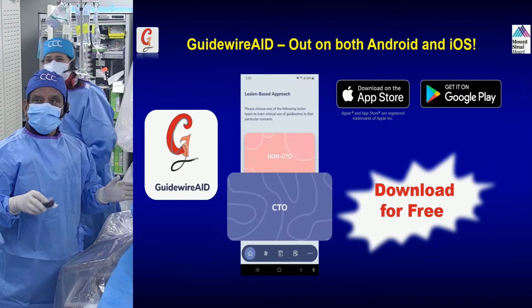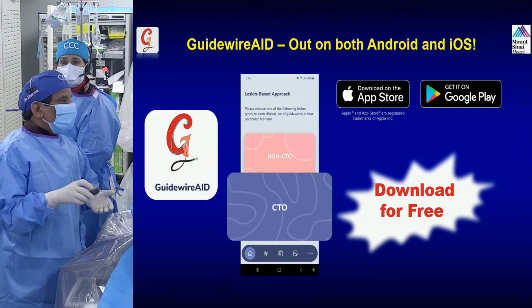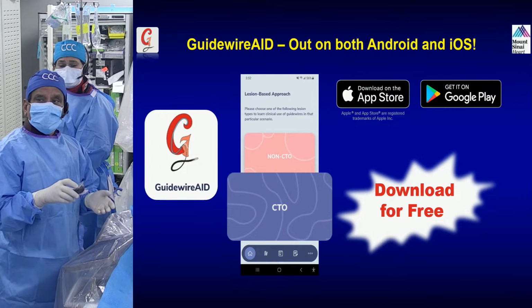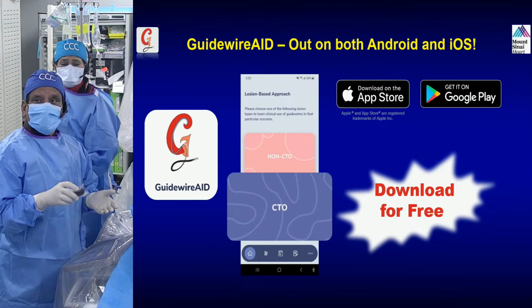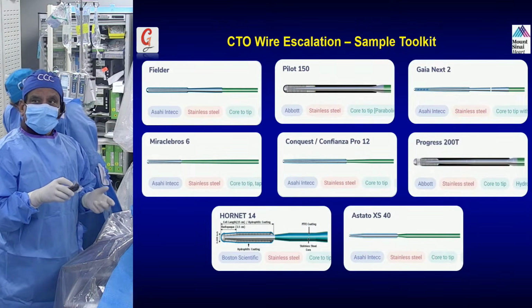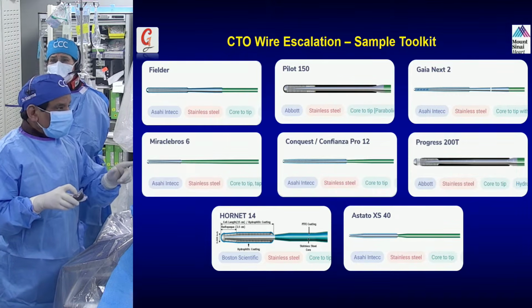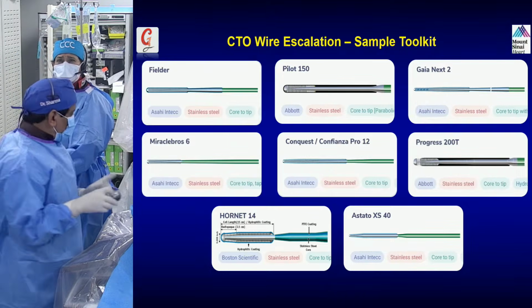CTO. Keep going. No, but I'm moving this. Yes. All right, there is no download. This is wired off. What a wonderful demonstration. We have the download file. It will be in the end.